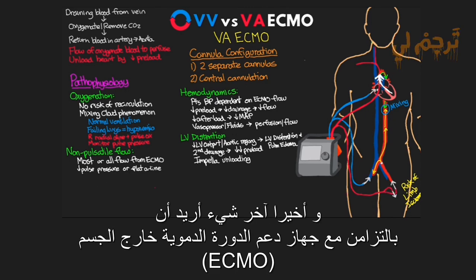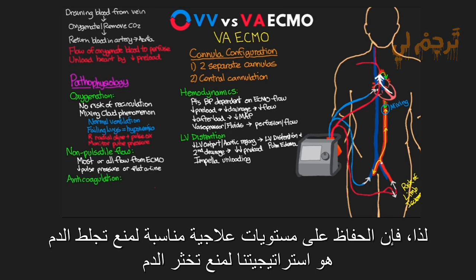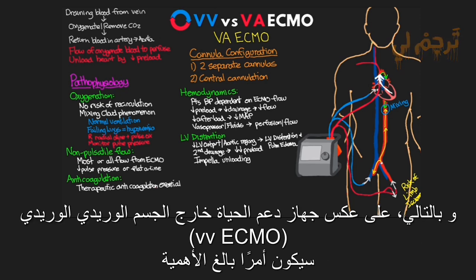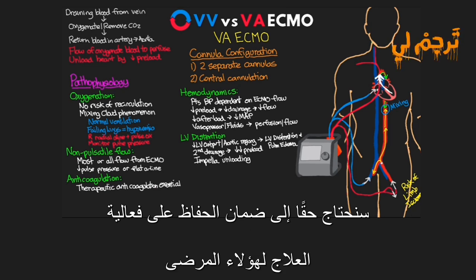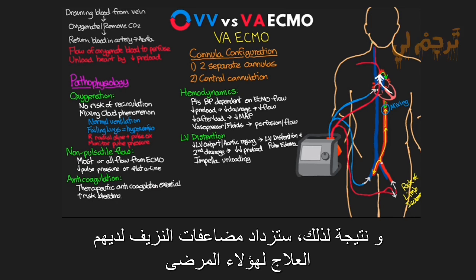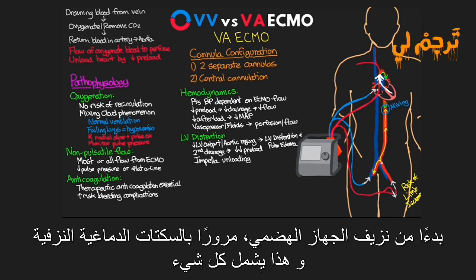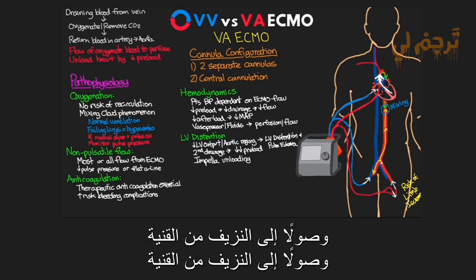And then finally, the last thing that I want to talk about is going to be our anticoagulation strategy. So on VA ECMO, maintaining therapeutic anticoagulation is really going to be essential. And so, unlike VV ECMO, we're really going to need to ensure that we remain therapeutic for these patients. As a result though, bleeding complications are going to be increased for them. And this goes for everything from GI bleeds and hemorrhagic strokes, as well as even just bleeding from the cannula sites.